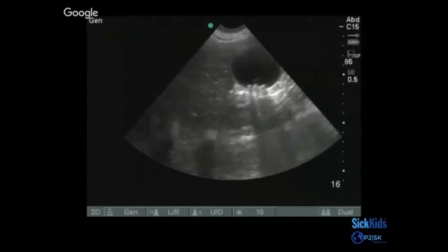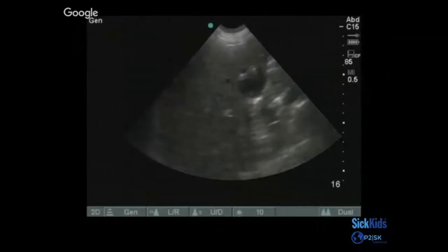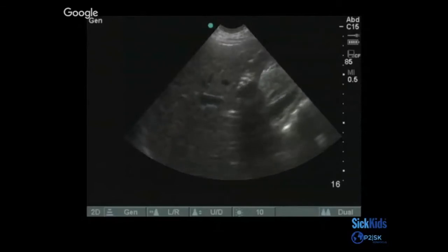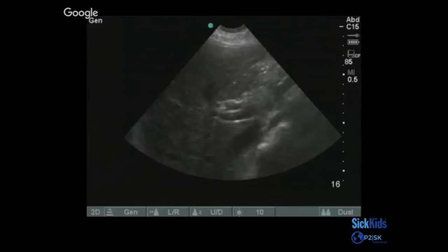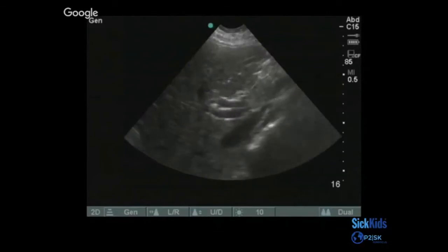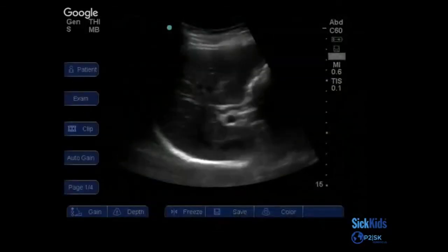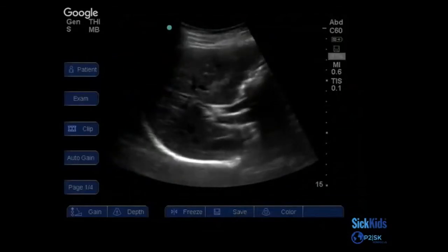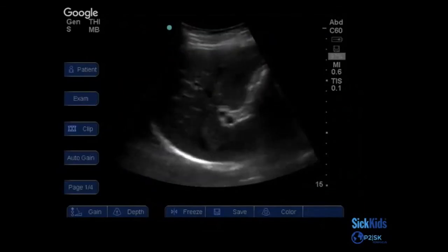Here's another view and another image, and in this one again, you'll see that large structure come up underneath, the double barrel kind of sitting down there. See that double barrel? That's an enlarged common bile duct. Here's an even clearer one. Now I don't have any clips where someone stopped and measured, unfortunately, but these are just some examples where they were enlarged. Do you see that double barrel?